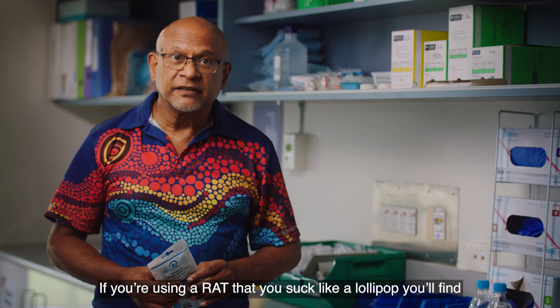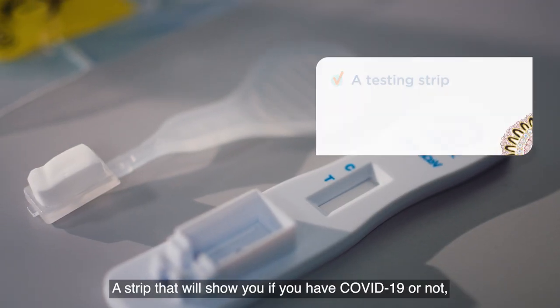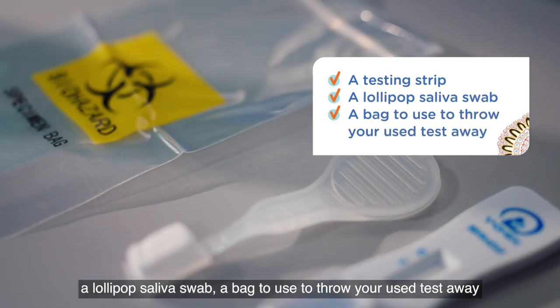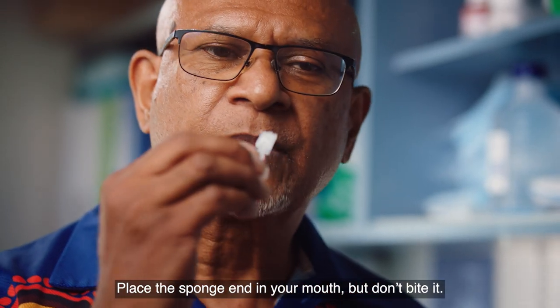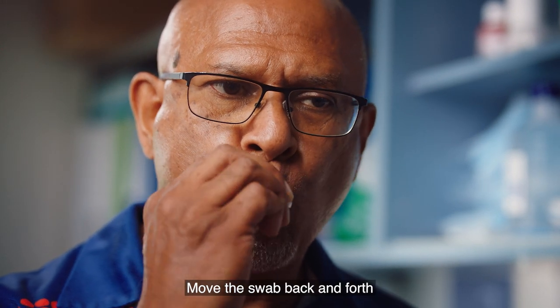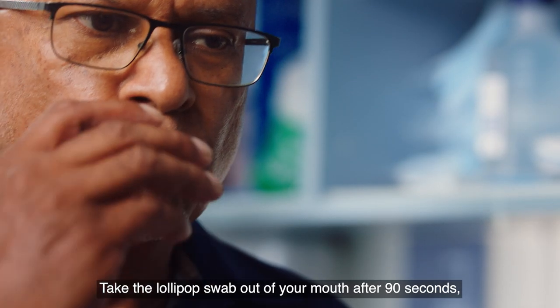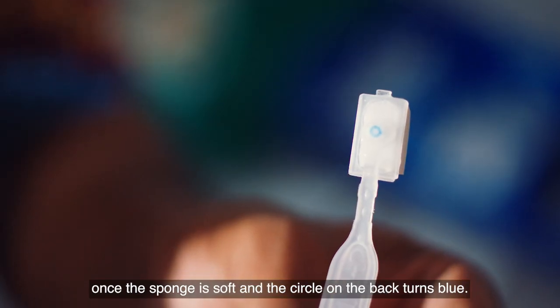If you're using a RAT that you suck like a lollipop, you'll find a strip that will show if you have COVID-19 or not, a lollipop saliva swab, and a bag to use to throw your used test away. First, take the lollipop out of the packet. Place the sponge end into your mouth, but don't bite it. Move the swab back and forth in the front and sides of your mouth for 90 seconds, then take it out once the sponge is soft and the circle on the back turns blue.